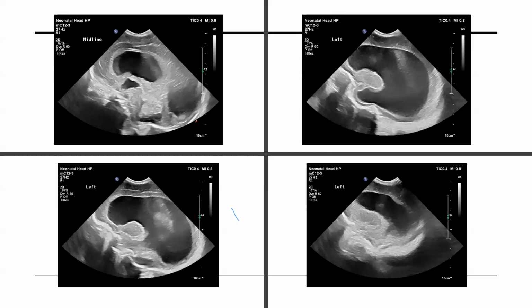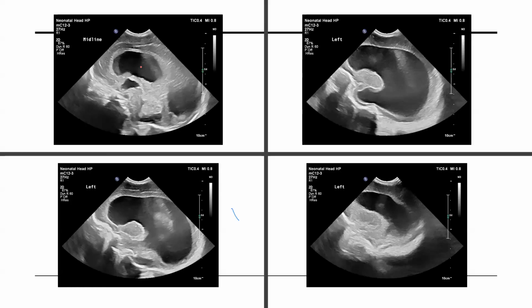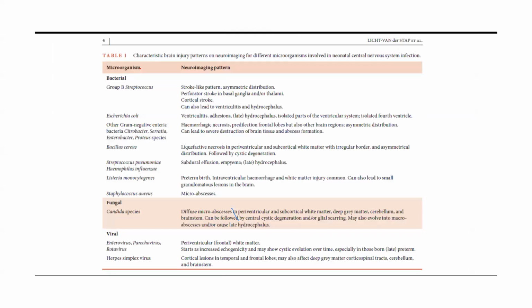So we had to continue antibiotics. If you look at the midline, just look how bright it looks. The third ventricle is also dilated, and the fourth ventricle is nearly collapsed. So you really worry that exudate has probably blocked the ventricular system, which is causing the third ventricle to dilate, which is causing back pressure into the midline, which is causing the lateral ventricles to dilate. And this is classical ventriculitis for you.